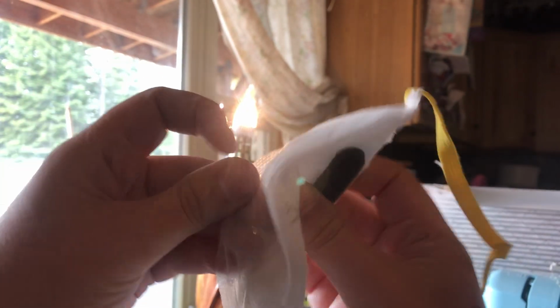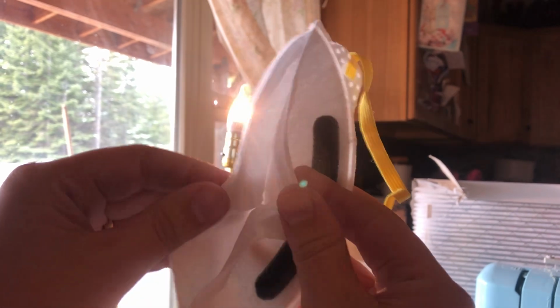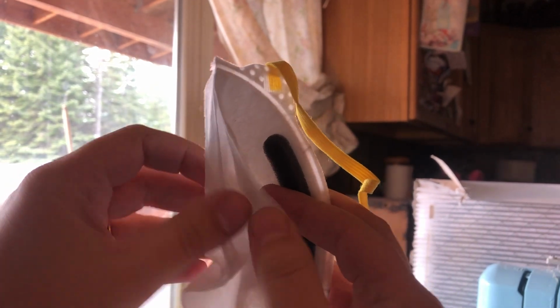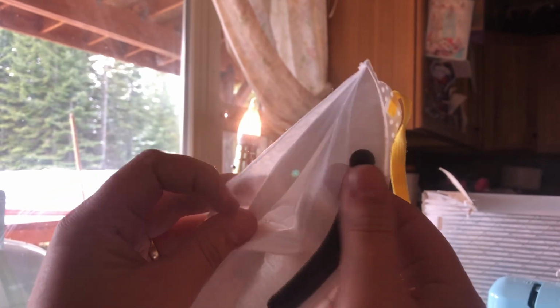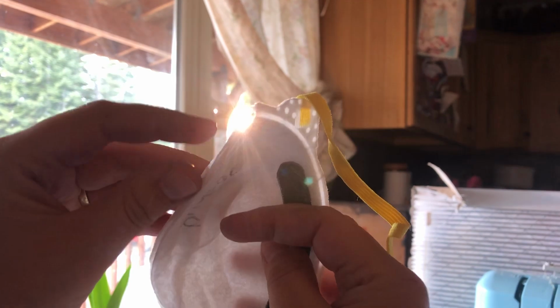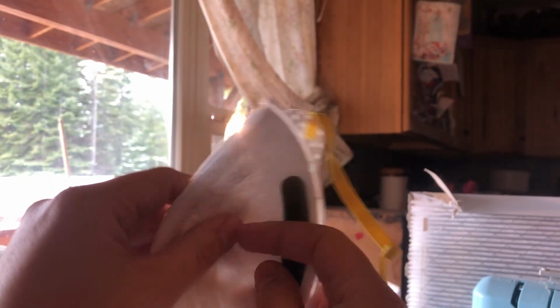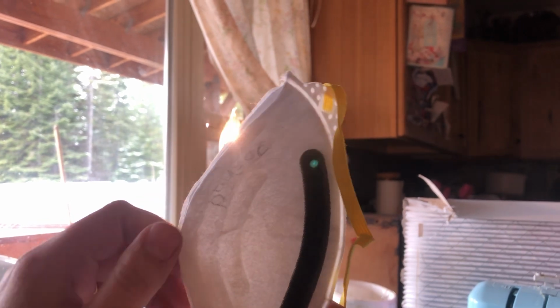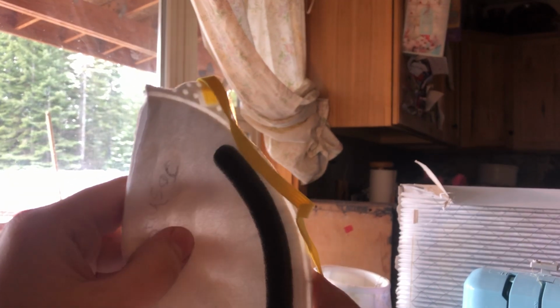So I see this outside layer is basically the cover, and then the next layer is part of what holds its shape. And of course, I think all of these layers are designed to help the filter. This inner layer helps hold its shape. So this thing is held off your mouth and your nose. It's not breathing into your mouth when you're trying to talk. You're getting sweaty, and it's not falling apart on your face because you got it wet.